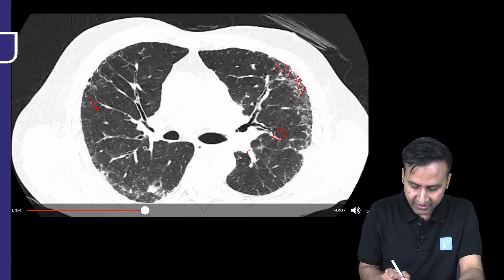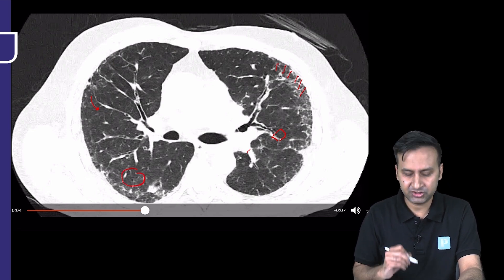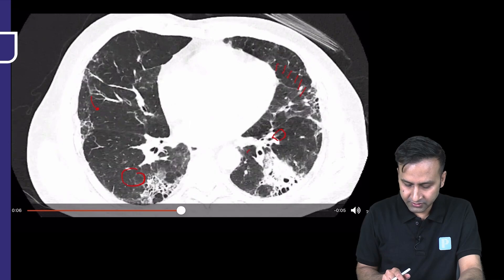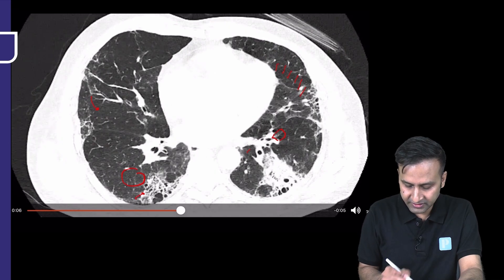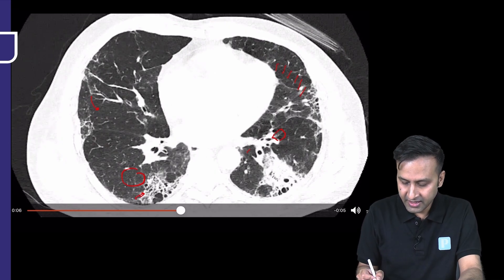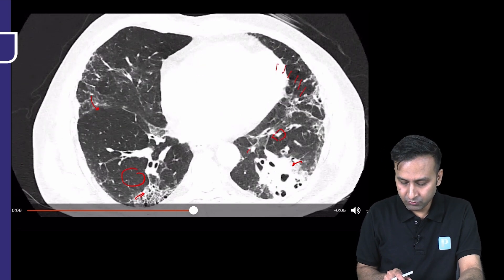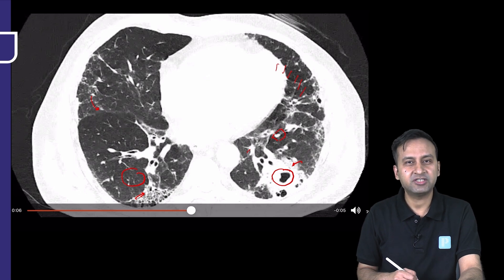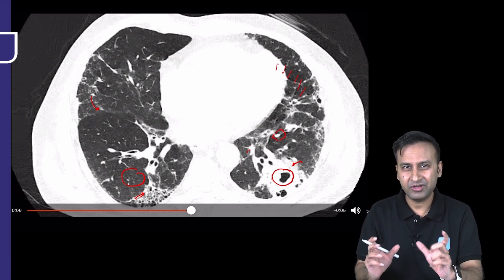Going further down, there is an area of slightly increased attenuation in the lung parenchyma — probably patchy ground glass opacity. Going further still, there is an area of exuberant honeycombing here as well, admixed with some ground glass attenuation. There is also an area of cavitation in the left lower lobe, admixed with all the other changes discussed so far.